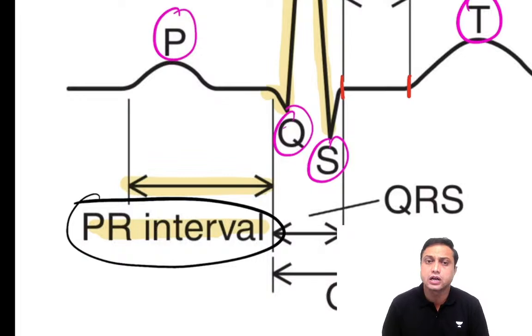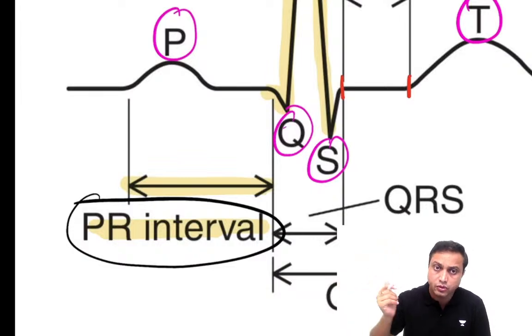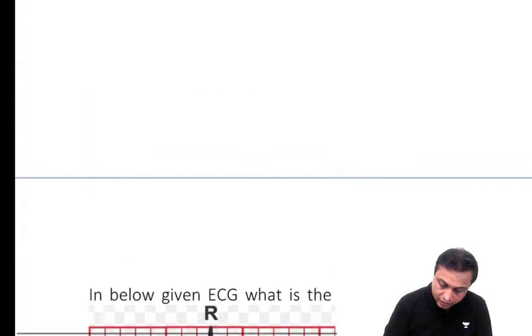Why am I focusing on the PR? P is a different concept. We need a long discussion on the P wave, but I am going to stick to the basics, so I'm just going to emphasize the PR interval. I will come to each and every wave individually. But as of now, just to make this lecture more simplified, I'm going to focus on the PR first.